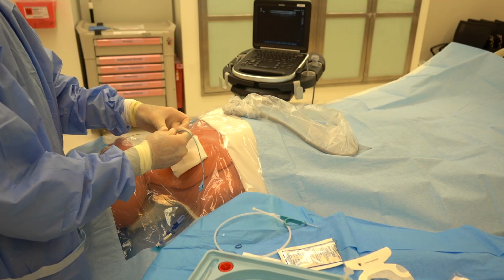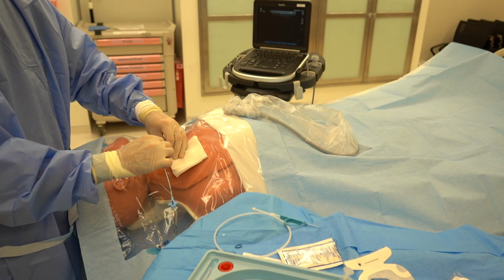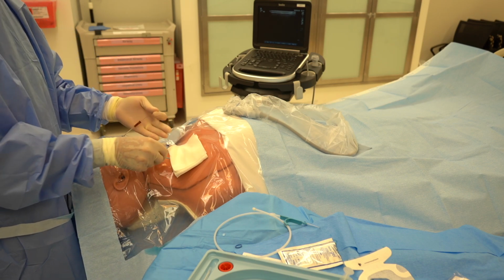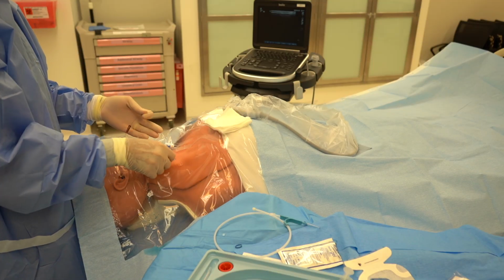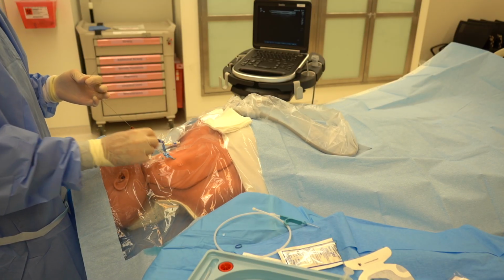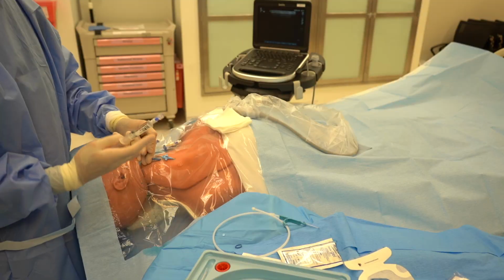We'll have our catheter that's been set up earlier. In this instance, we're going to feed the catheter through to the end, so we have never let go of our wire in this stage. And once we have a grasp of our wire, we'll start threading our catheter over our wire to the appropriate depth desired. And then once we've achieved that depth, we'll take wire out and say wire out.